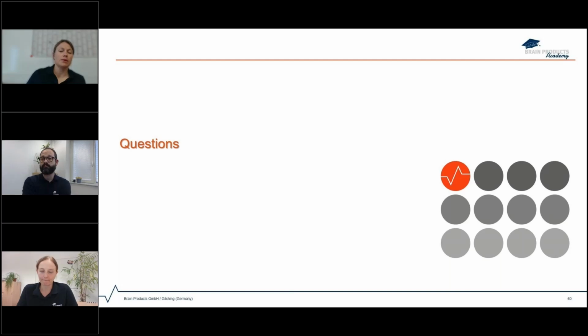Sure. There are possible methods for modeling respiration effects, and we can do this mainly from a data analysis perspective. But one of the best things we could do is actually to measure respiration within our data sets. A lot of times there are issues when just using more clinical devices for measuring respiration rate, because we always have the issue of not having perfect timing between acquiring our fMRI or EEG data and some respiration signal.